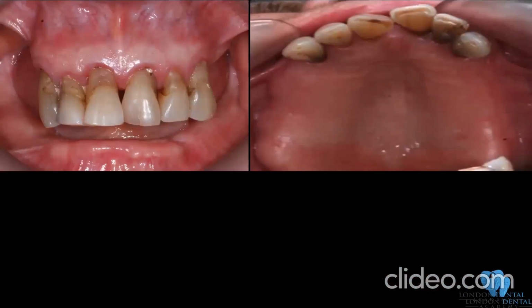Now, I'll discuss with you this case. A lady, I think an Italian lady, presented with Sjogren syndrome, cervical caries, being restored at the dentist, very severe dry mouth. Dentures in such cases are difficult, I would say. It's really difficult. I think it's not easy to deal with these cases. So what can we do for such patients? Well, I think we have got many options: either lower denture, upper 2 bridges, upper partial denture.